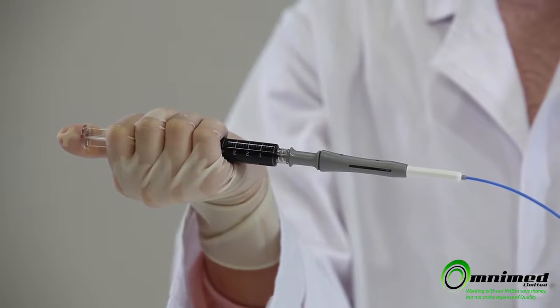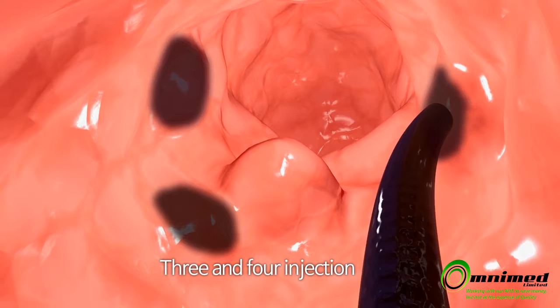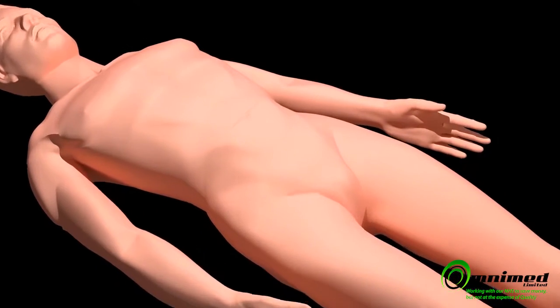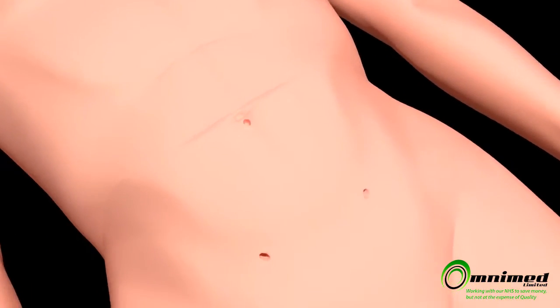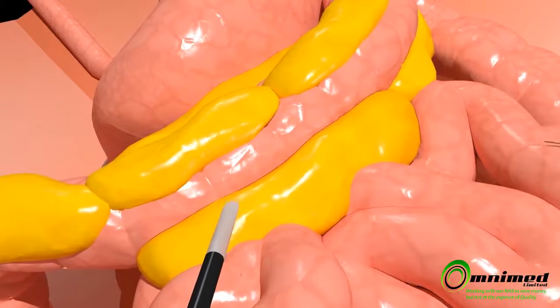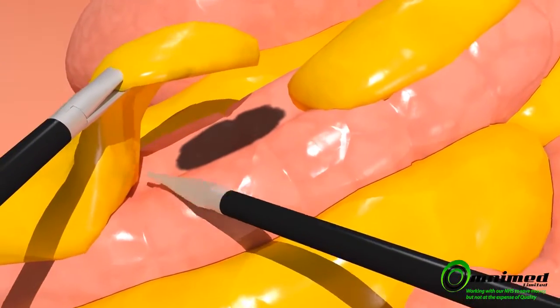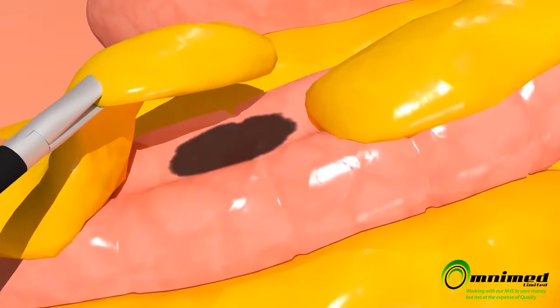With one Black Eye, approximately four injections are recommended around the area of the lesion. Injecting Black Eye this way allows easier observation of the area of the lesion through a laparoscope. Black Eye is a solution to easily and securely identify lesions for subsequent removal.